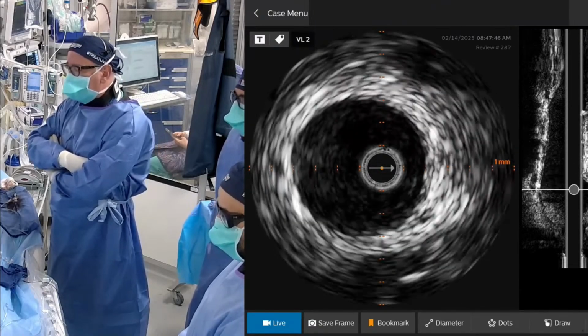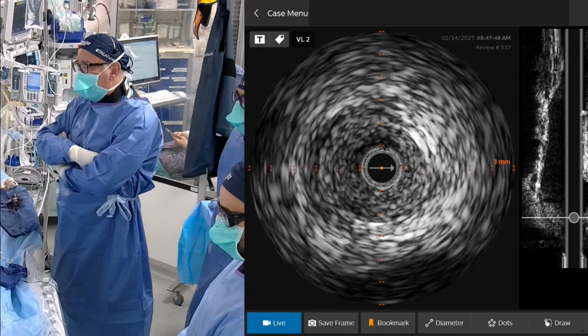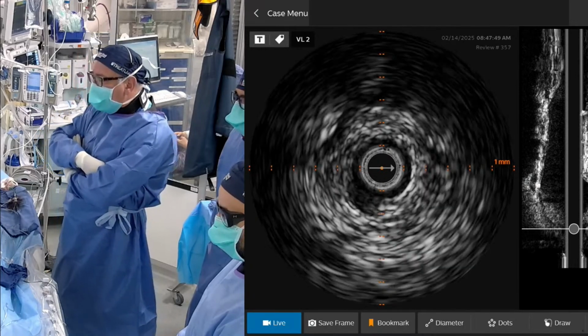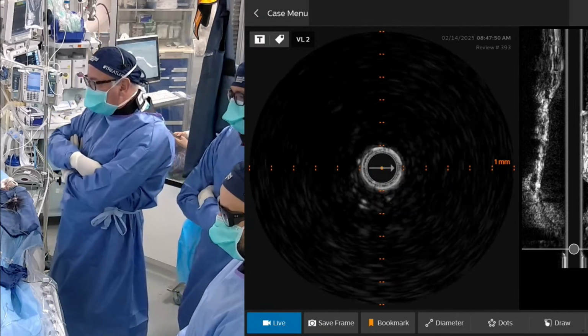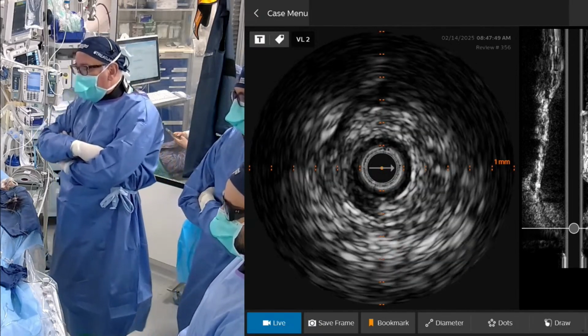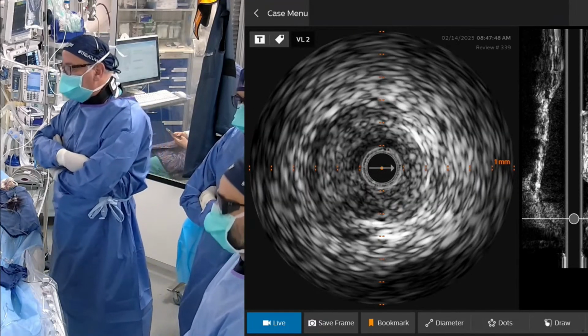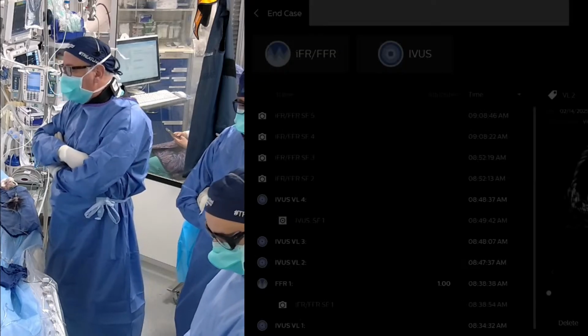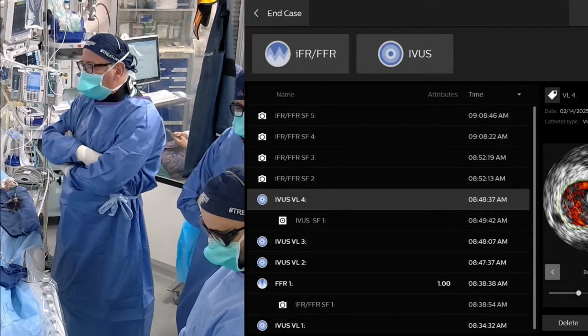And you start to see that the vessel becomes just obliterated very readily there. What's interesting is that it's really an intravascular process. This is something that's involving the renal artery here. It's not an extrinsic process. It's not a compressive process from the aorta. It's really an intravascular renal artery process.